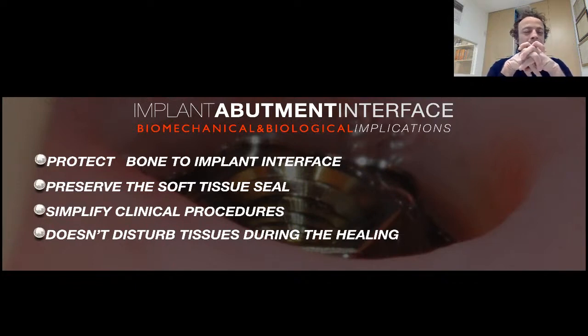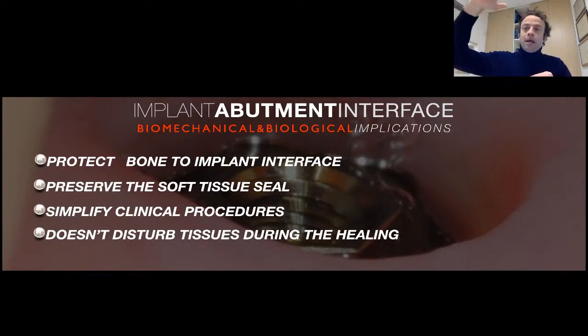And this is, for me, really crucial, a must, in particular in the full edentulous patient, to work always at the abutment level. So place the abutment immediately during the surgery, an abutment that normally moves your prosthetic interface more coronal. The height of the abutment can be evaluated in relation to each clinical situation. What I can tell you is that I always like to maintain at least 3 millimeters from the implant platform to the soft tissue level, to the gingival margin.